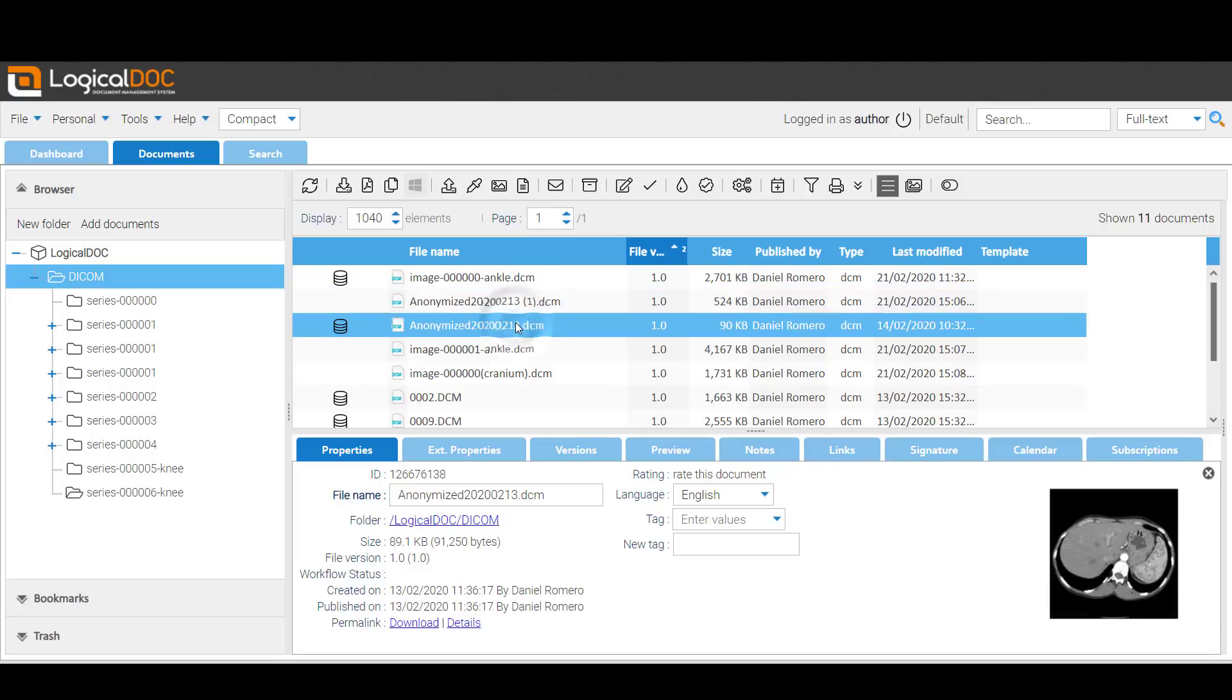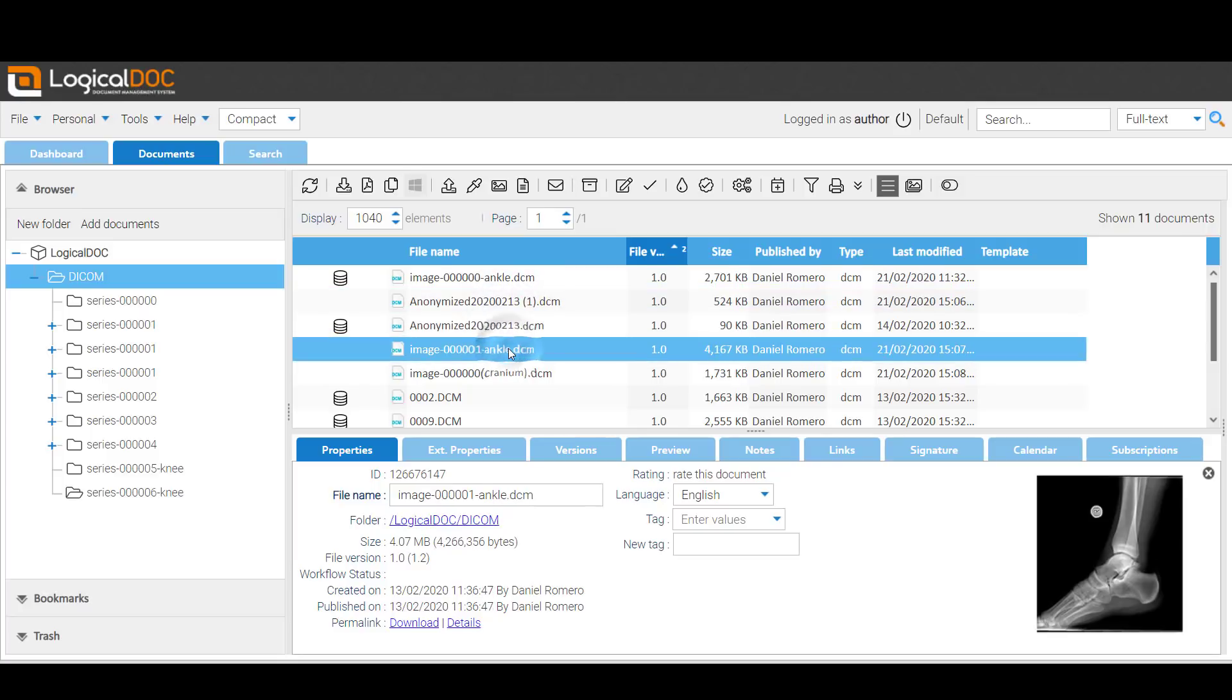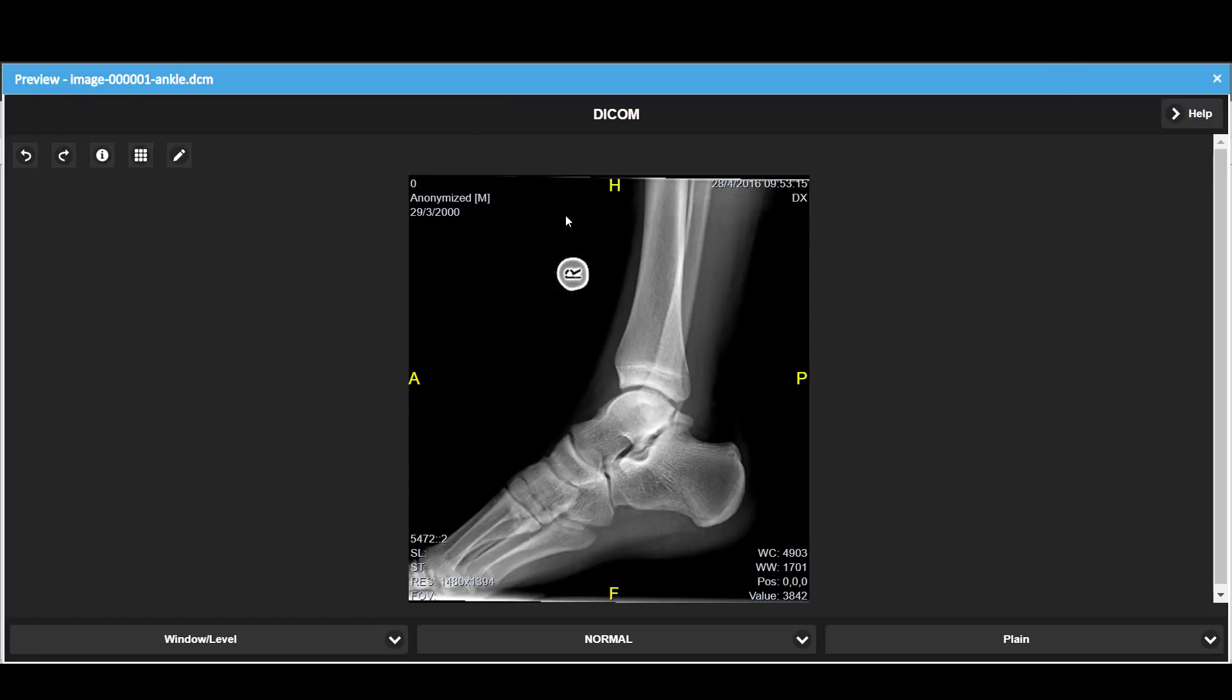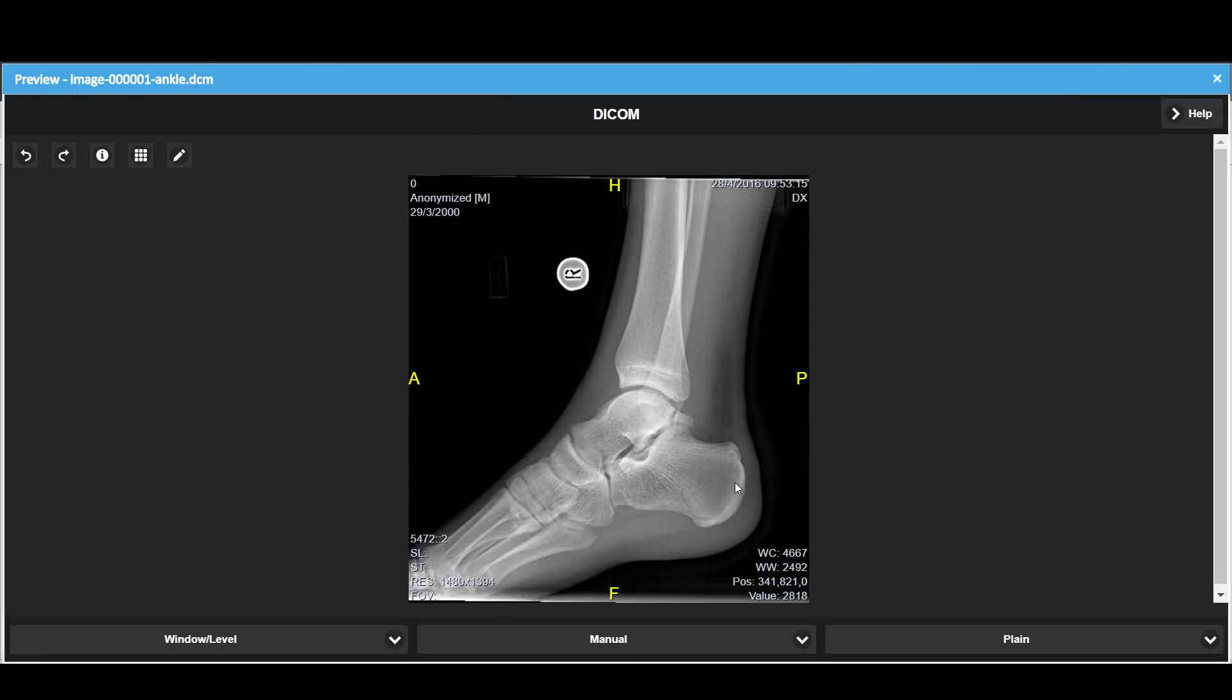Now let's activate the full screen preview. By dragging your mouse, you can increase or decrease the contrast.